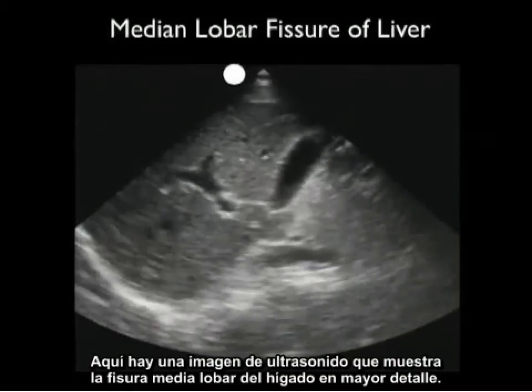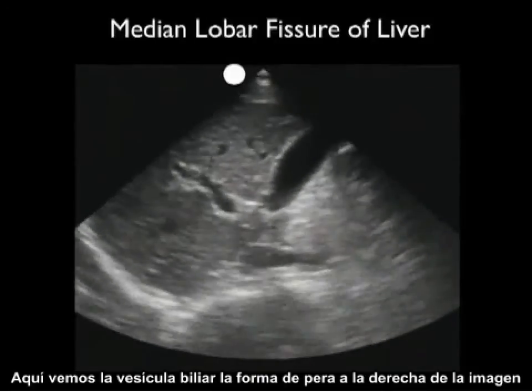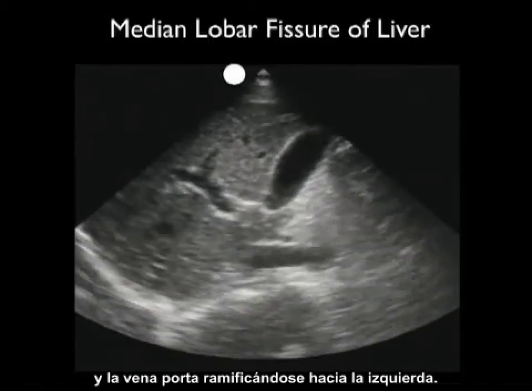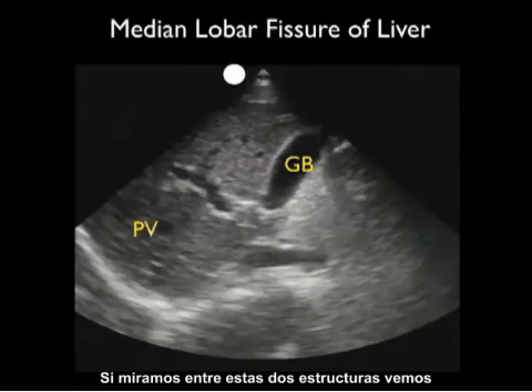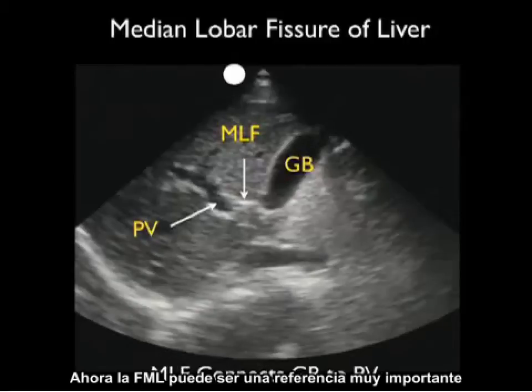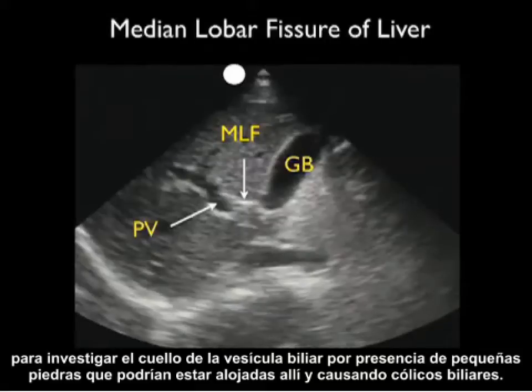Here's an ultrasound image showing the median lobar fissure of the liver in greater detail. We see the gallbladder, the pear-like structure to the right, and the branching portal vein to the left. In between the two structures we see the thin white line known as the median lobar fissure. The MLF is a very important landmark for walking from the portal vein up to the neck of the gallbladder to inspect for small stones causing biliary colic.